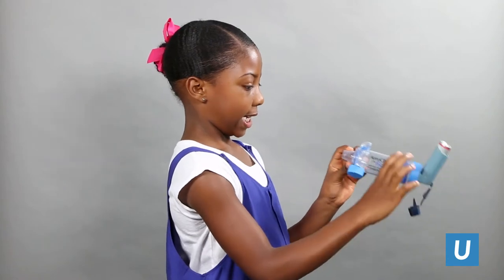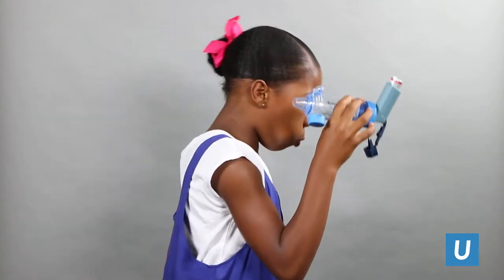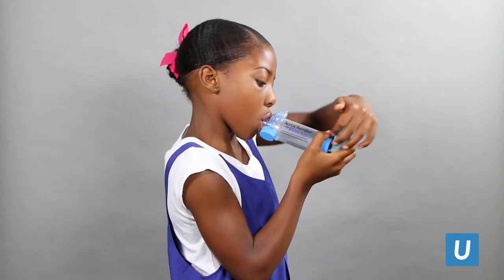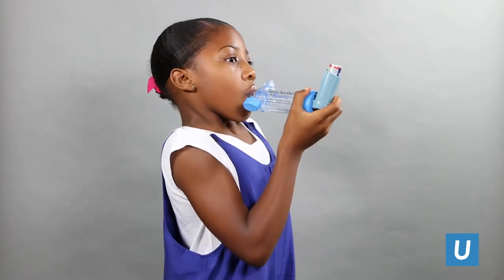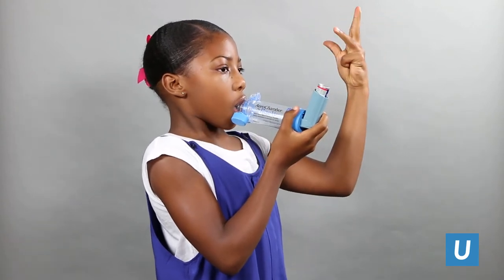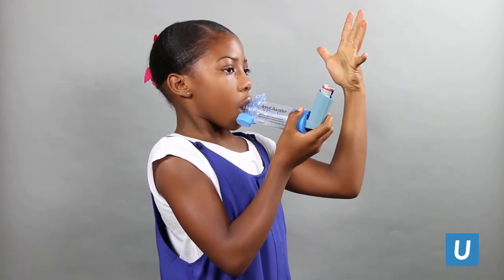Breathe out all the way, close lips around the mouthpiece, press down on the inhaler, breathe in slow and deep, hold your breath for 10 seconds if you can, then breathe out slowly.